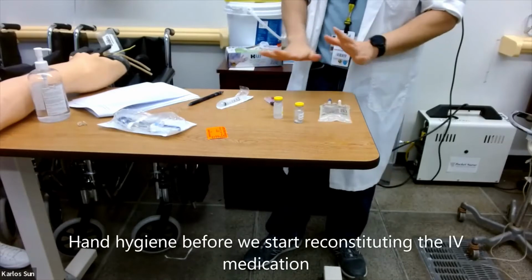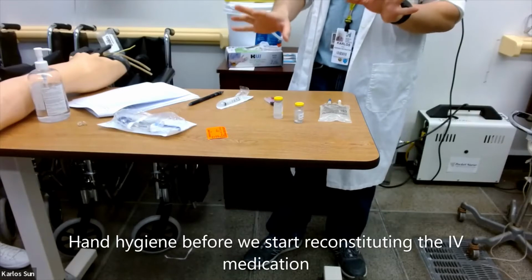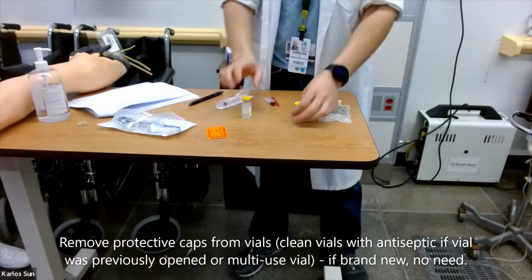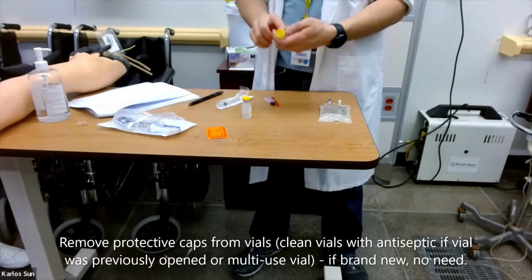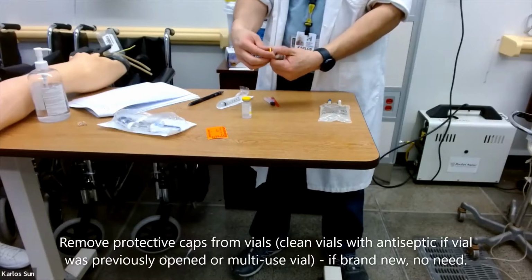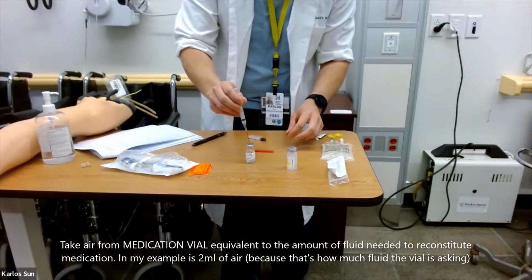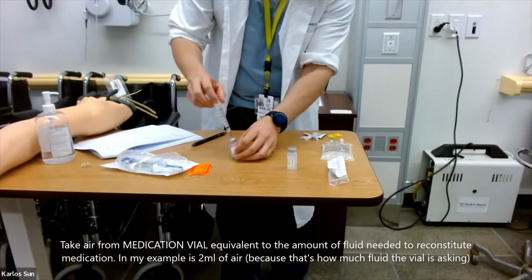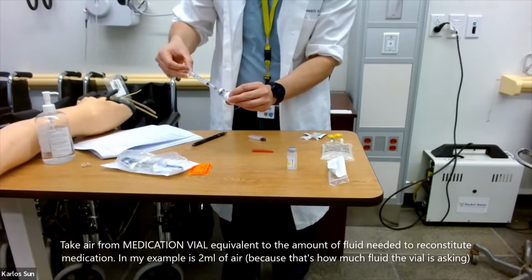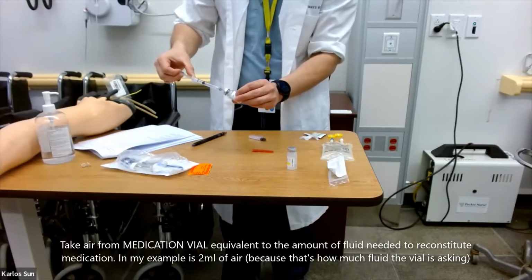Start by performing hand hygiene. Remove the protective caps from the vials. Now remove air from the medication vial equivalent to the amount of fluid needed to reconstitute the medication. In our example, it's 2 milliliters of air.